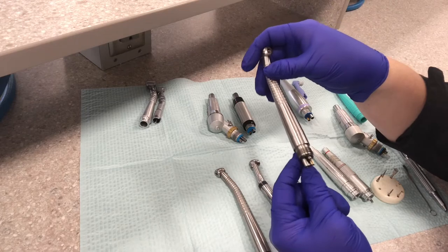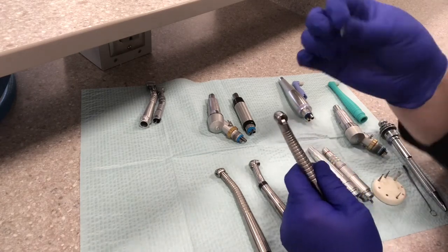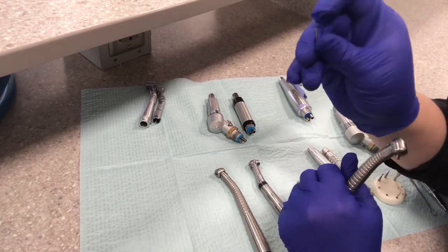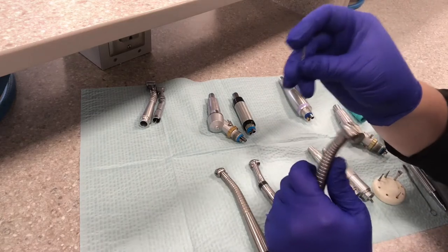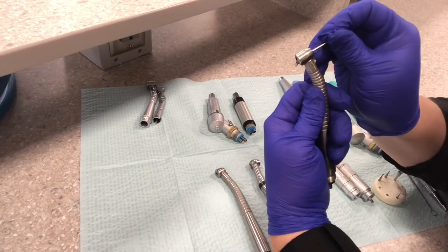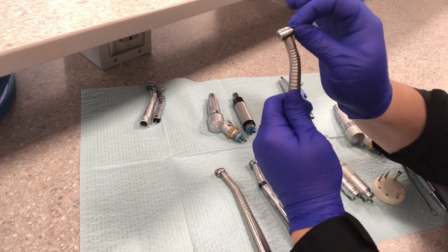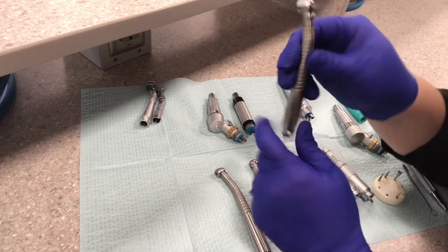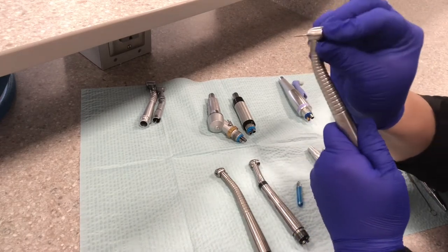We'll get into the specific numbers for that once you're in lab. All high speed burrs have a smooth end to them. There are hundreds of different types of burrs that go in the high speeds; they all do a different function. To place it, you put the smooth end down into the head of the handpiece. Then to lock it in place, you push that little lever up and pull on the burr to make sure it's locked. The fiber optic light shines through, and the water sprays through there. So this is again the power lever or the latch.